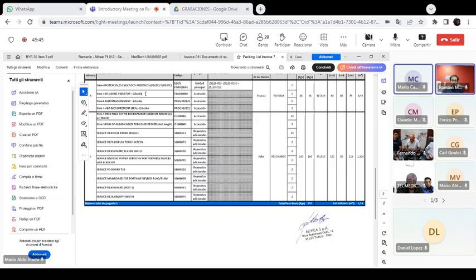So yeah, okay. So everything is okay. We just have to send you a license for the audiometry. If you want to open up the audiometry window, it will be okay, I think. One question, Romain, do you need to know the serial number of the device to enable a specific license?